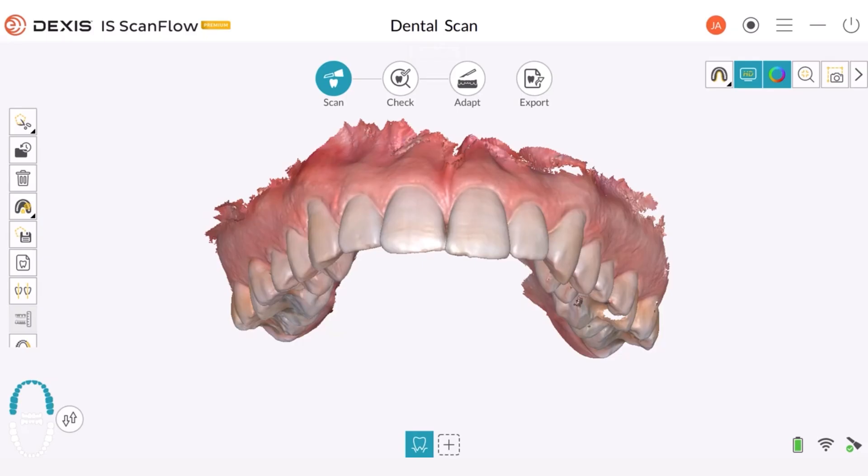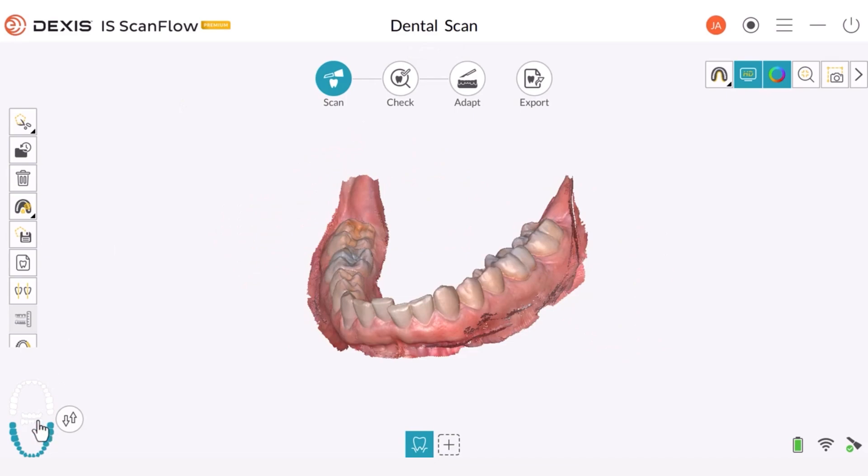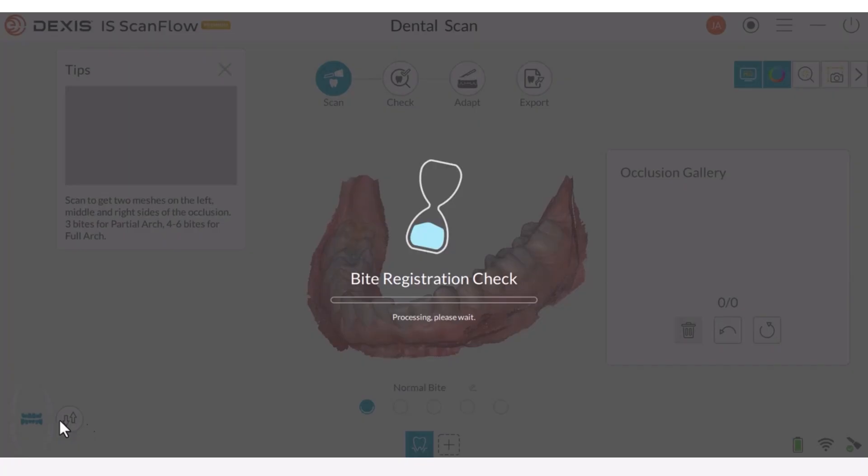In this session, we will explore how to take a bite registration. To start, first select the Buccal Bite Registration option in the IS ScanFlow software.